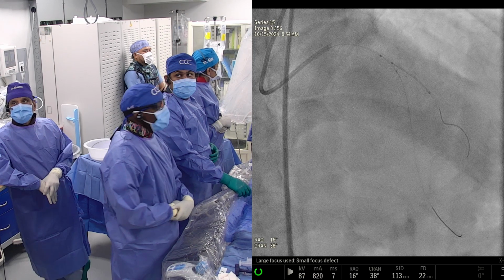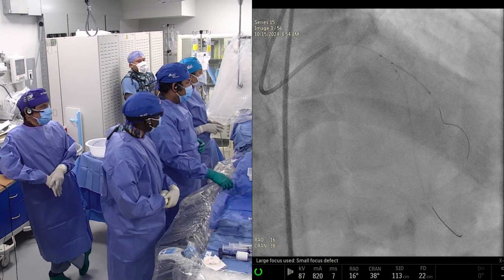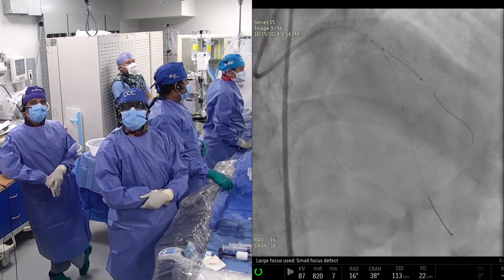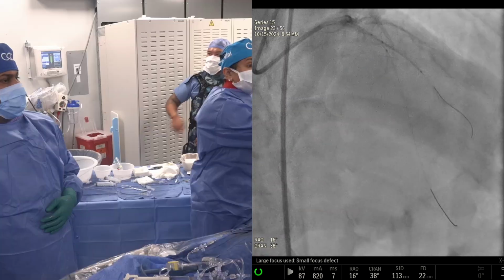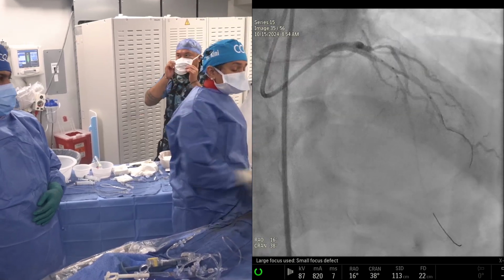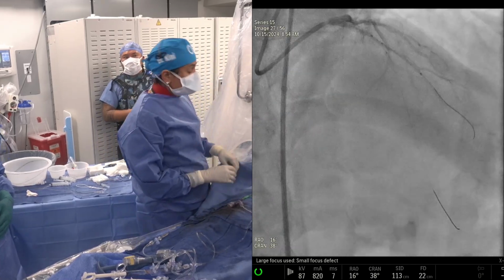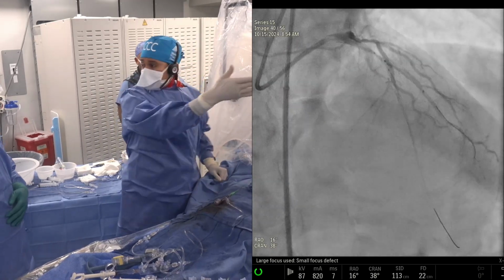Anu, you were going to tell us something about the case? Yeah, so this is where we are. This is the placement of the stent. And if we need to do the drug-coated balloon, we can put a 2.5 x 30 drug-coated balloon. There's no 40 millimeter, right? Let's go with the 2.5 x 30 balloon if we have it, we may decide. I'm saying if you want to, you can decide with the case of the distal. Now, the other question is there was a paper actually in the CTO. Can I finish showing? Yeah.